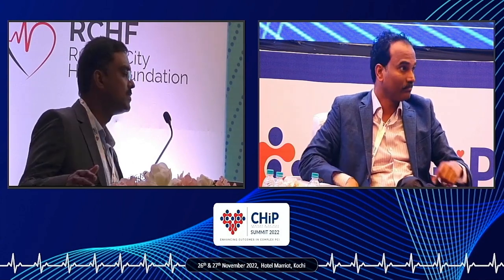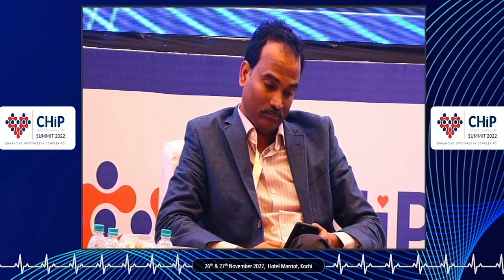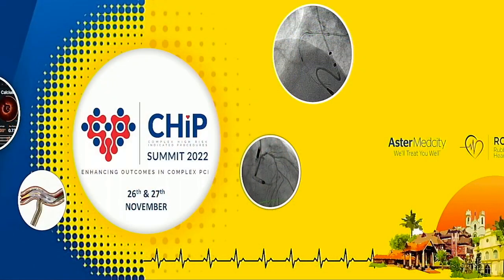You have a situation wherein you have crossed a CTO with a wire, you have no imaging available, and you have both the laser and rota available. What will be the choice? Obviously, laser. Rota has the stent ablation. No, there is no stent. This is a native CTO lesion. You have crossed the lesion. No balloon is going. No imaging is available. You have both the options.